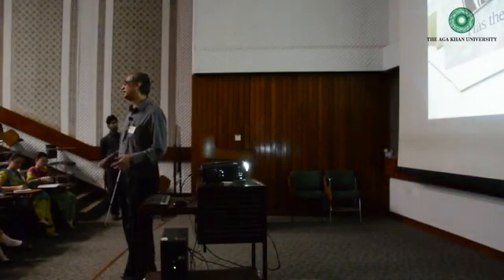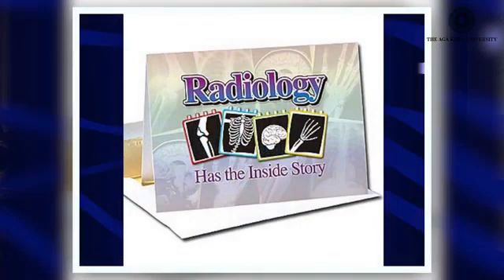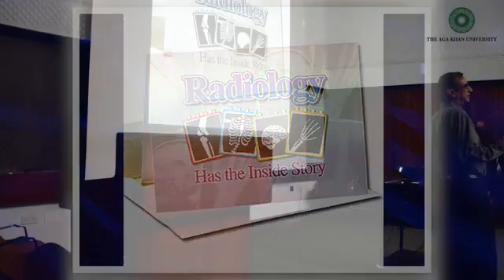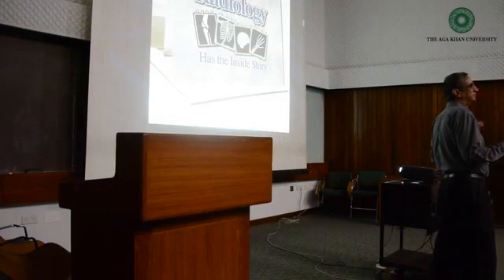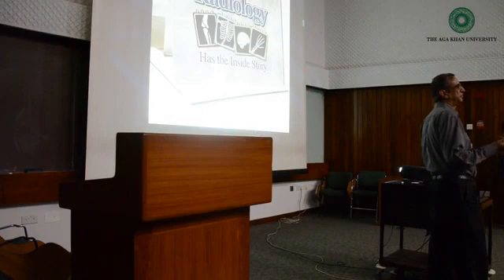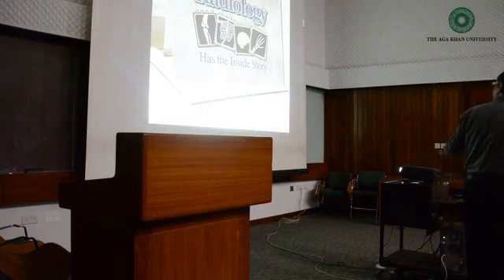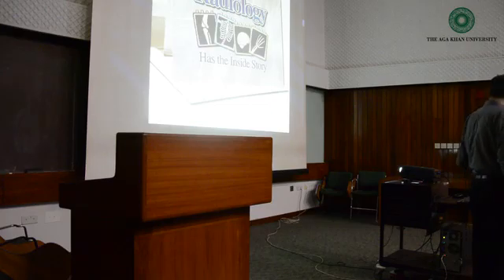Unlike a photograph, which shows you the outside, X-rays or medical imaging show you inside. X-ray will show you the skeleton, which is not visible in a photograph. So while a photograph shows you outside, this shows you inside. That's why it's said to be the inside story.